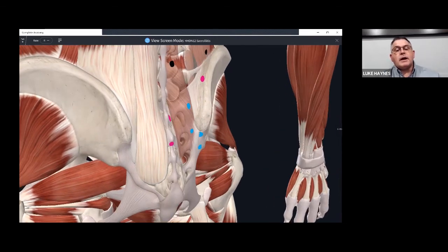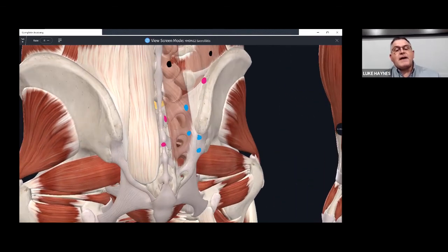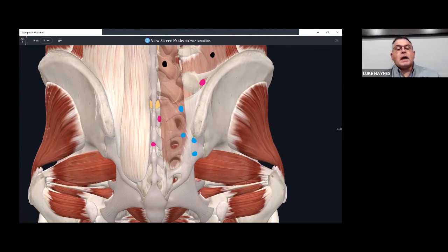Once we get those in there, that is a very dense fascial plane that will require a little bit extra movement, a little extra force to get the needle through that ligamentous sheath. Once we're in there, we can definitely do some good needle manipulation for that.